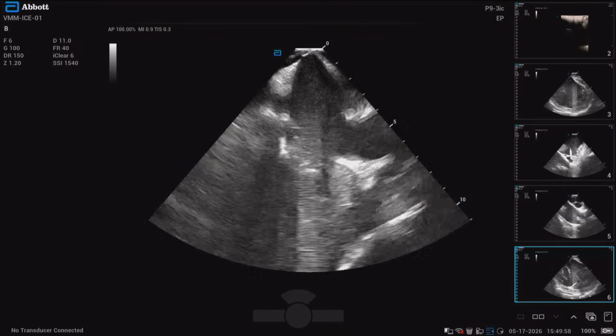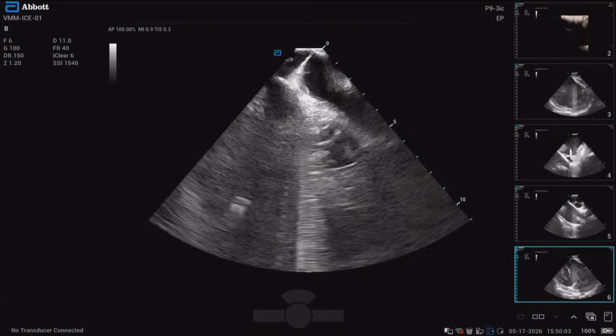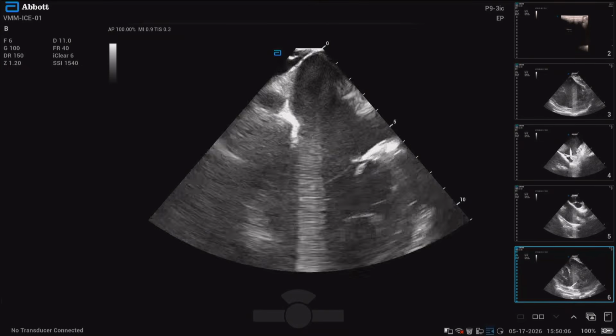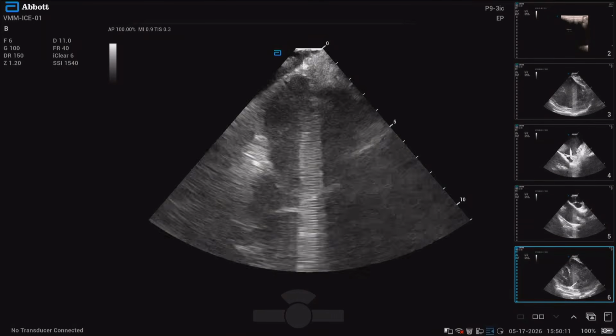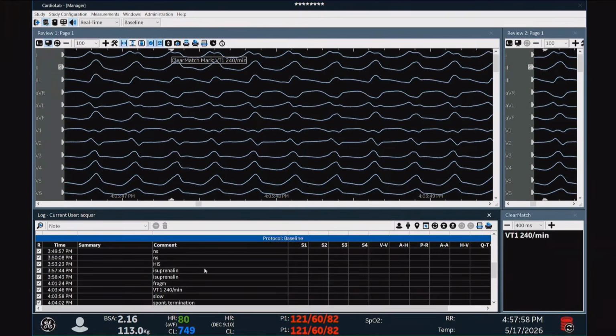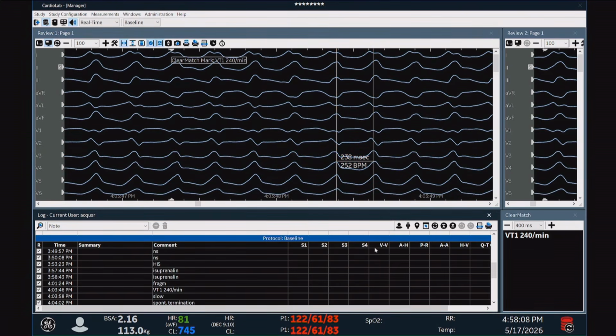To our surprise, when we could not induce tachycardia, we paced from the right ventricle, the left ventricle, then we gave some isoproterenol, and we induced a rapid VT, 240, which might be more or less a similar cycle length as the clinical arrhythmia, but you see a morphology which does not fit this apical or apical septal aneurysm at all. So this is from basically the upper part of the basal septum. And we did pace mapping in this area, and maybe Christian will explain more now.